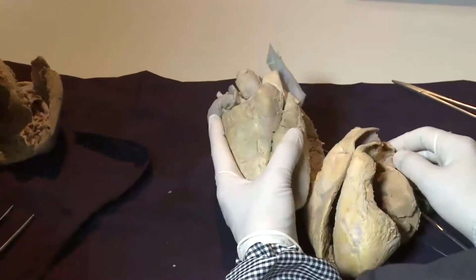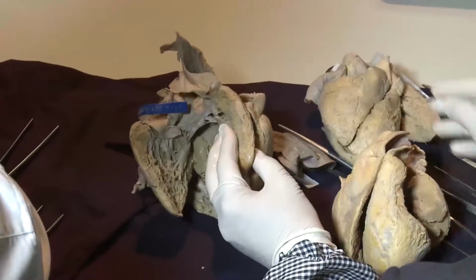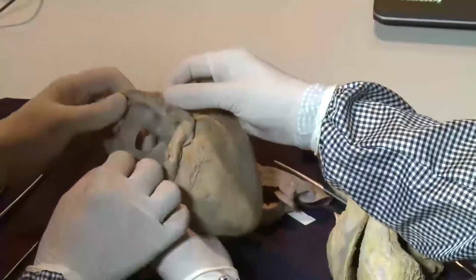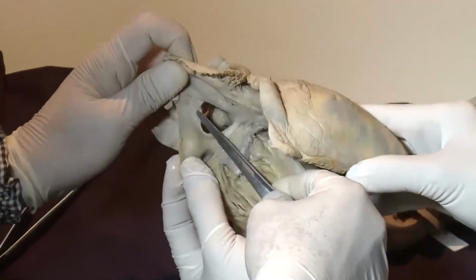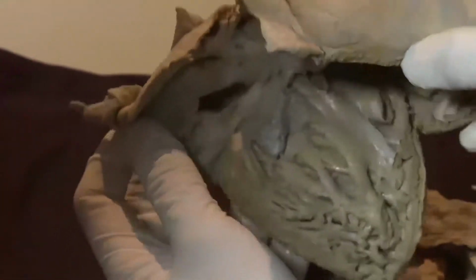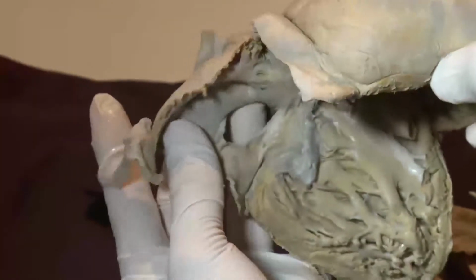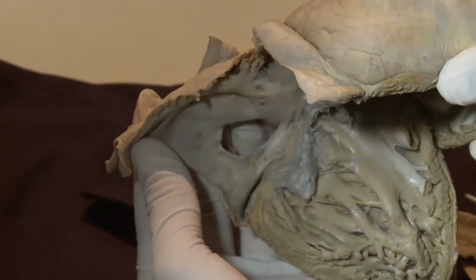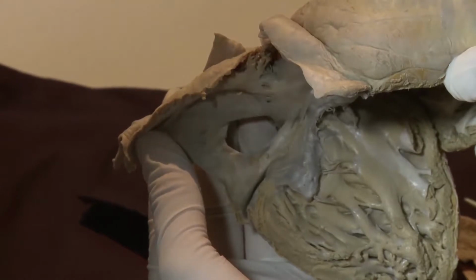Dr. Kim, what is the best way of visualizing that posterior limb? Do you think the CT is needed every time, because it's hard to see that part? Posterior, yeah. In the echo, using a short axis view, you can measure the length of the posterior limb. And sometimes in the adult, it's very difficult to measure. Then we usually check the CT in adult patients to measure every length of the limb.